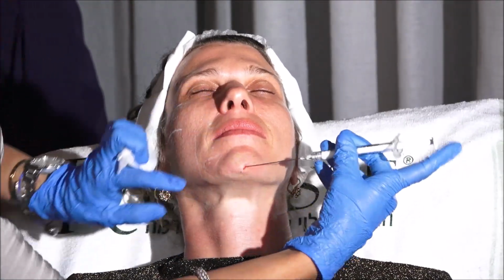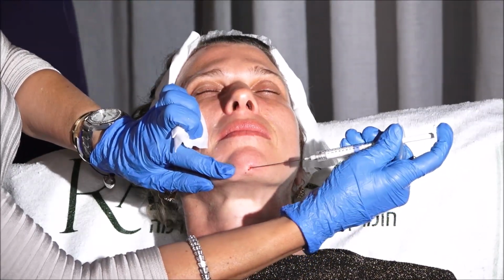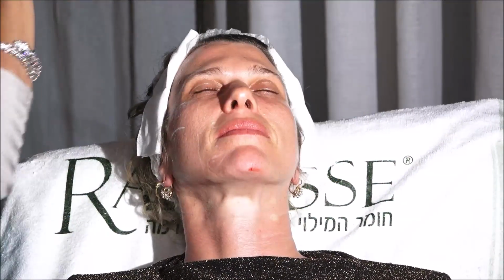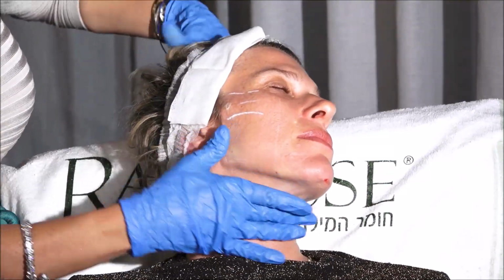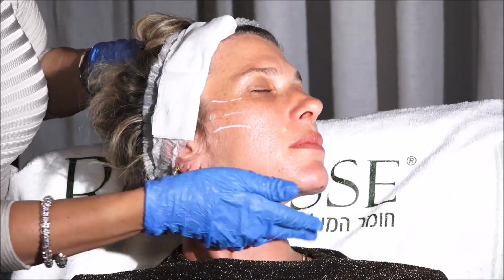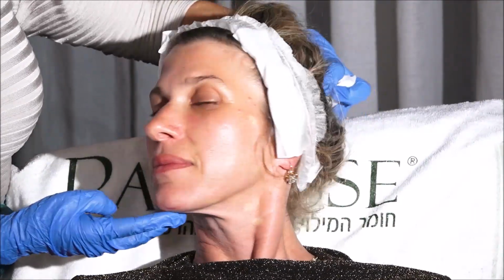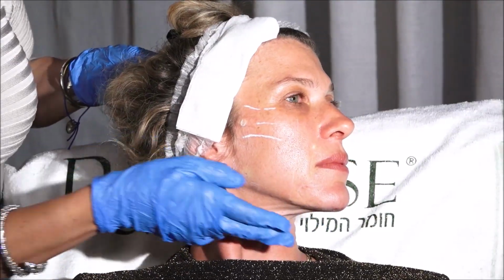And then I'm going to go lateral and give one trace. That's it. And I used half a syringe for her. Let me try to show her jawline compared to this side, which is beautiful, but here is amputated. Here, she has a good chin, better projection.